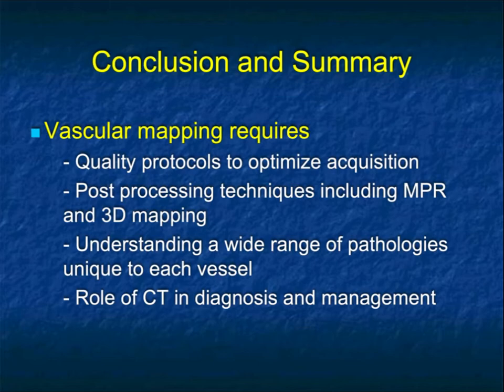We emphasized the importance of proper scanning technique. We emphasized the importance of post-processing. We understood the importance of the range of pathologies, which can look somewhat similar on CT, but the key is to understand the history or look for other findings that help you reach a diagnosis and the importance of CT in patient diagnosis and management. And with that, I'll stop there and thank you very much.